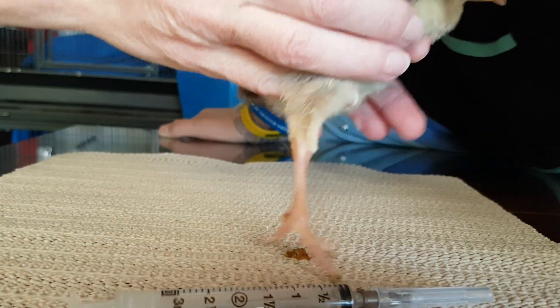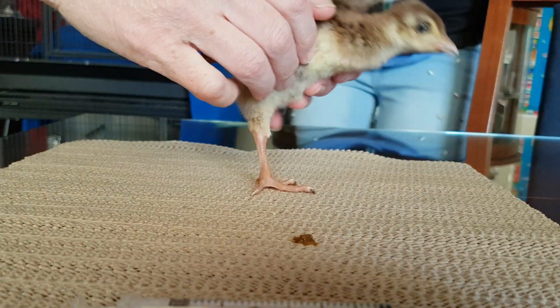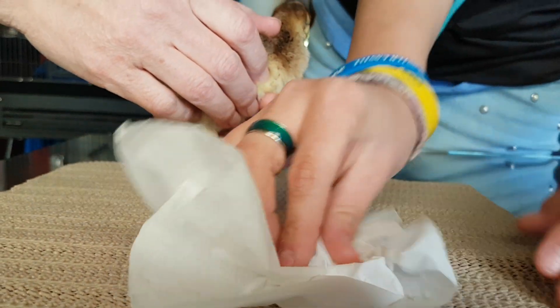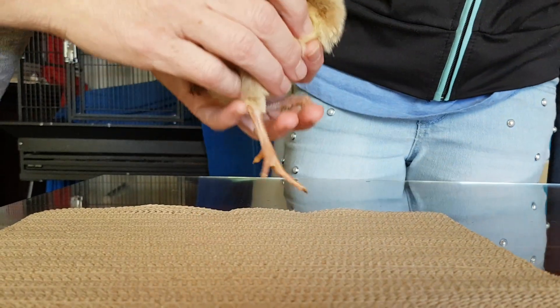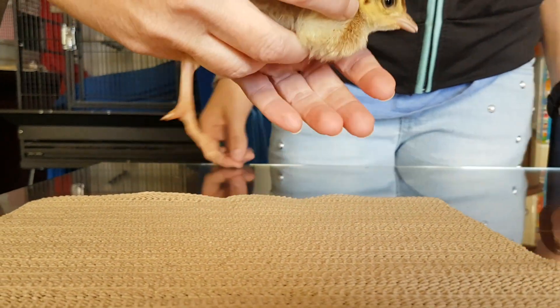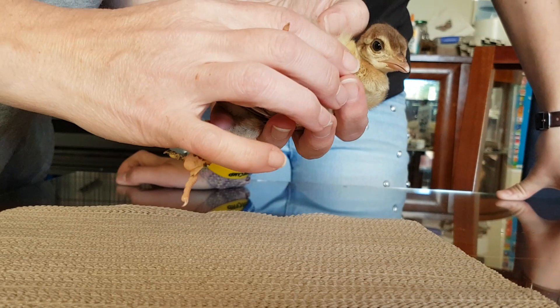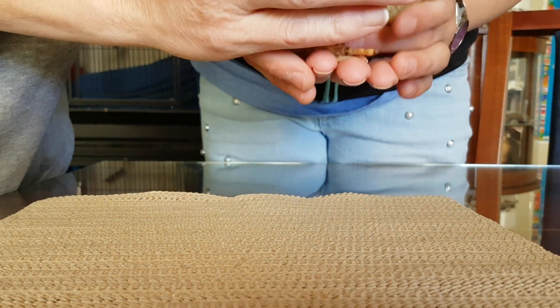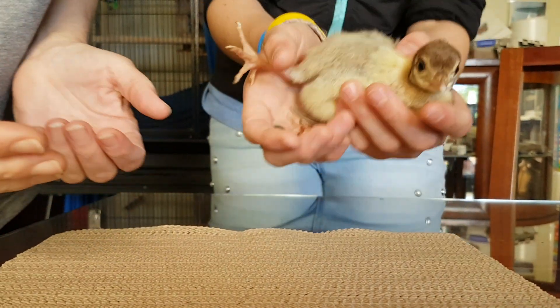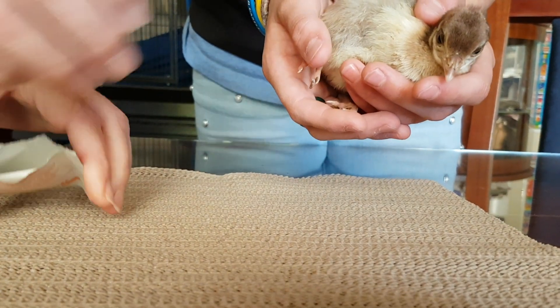So what we're going to do — Kat, you're going to hold her. Do you reckon you can hold her like this and keep her calm? First off, we will use a skin prick — or a white wipe?